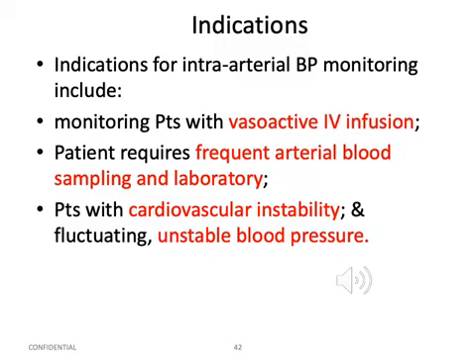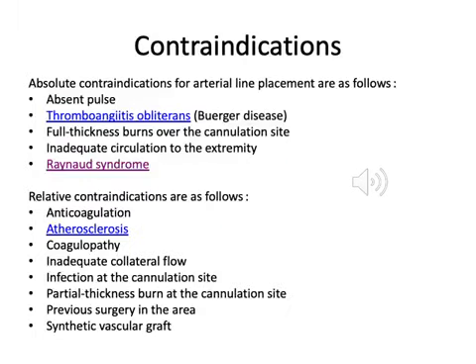Patients in the critical care unit, most of them may have unstable blood pressure and require vasoactive IV infusion, thus they might need intra-arterial blood pressure monitoring.